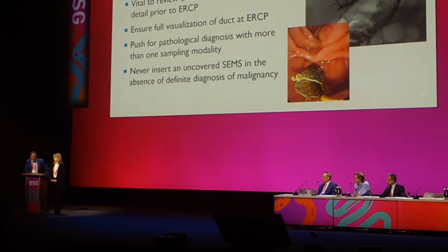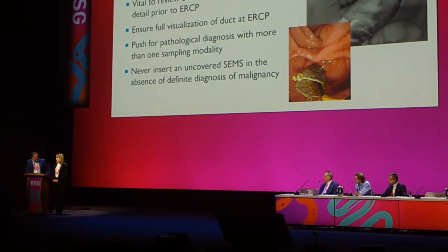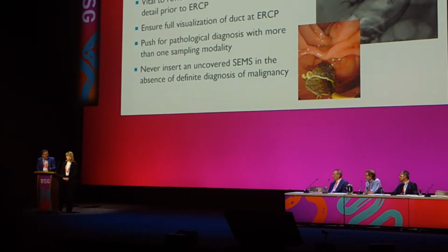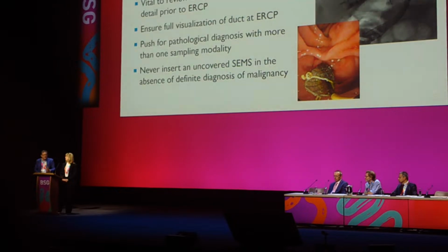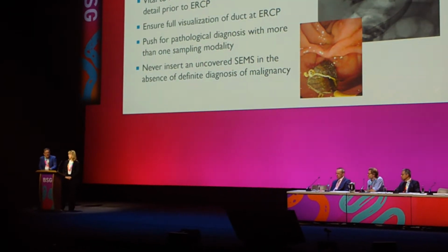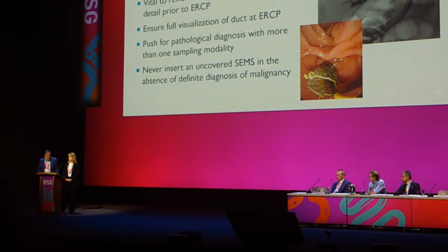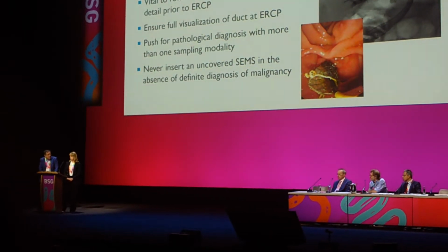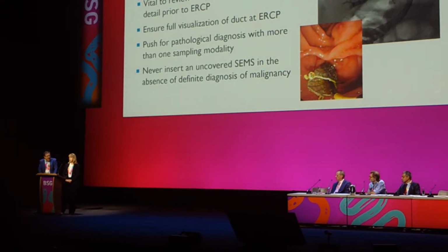Yeah, I think it's a really good point, and the emphasis needs to be on incremental. There are very few good studies directly comparing brush cytology with endobiliary biopsies with cholangioscopic biopsies. Most of them describe that single technique and give you a number. And in the cholangioscopy field, both for visual diagnosis and for tissue acquisition, there are very impressive numbers.